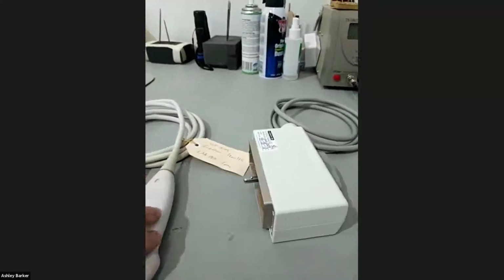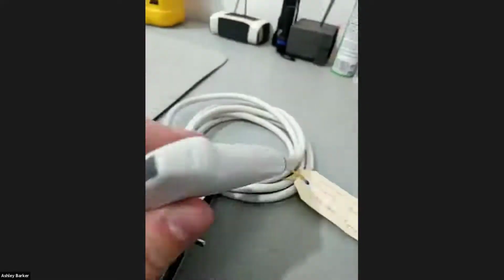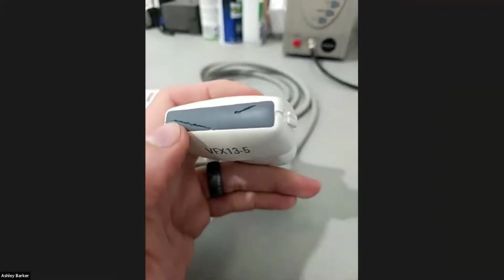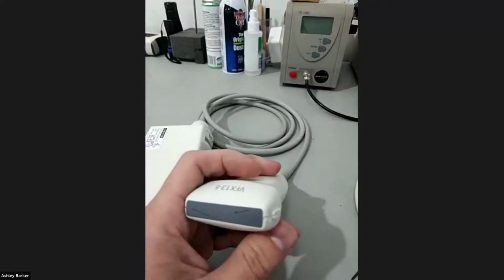Moving to the next one, this is a bit of a different look of lens damage. Can you give us a bit of an idea of expense? Like, I know commercial in confidence, but ballpark, just for that needle damage to the surface of the probe, we're talking hundreds of dollars, thousands of dollars. So again, it would be a little bit dependent on what damage has been done, because if that needle's cut right through the matching layer, then we need to replace the matching layer as well. But you'd be looking for something like that, probably the top figure, probably about 1850, something like that in Australian dollars.